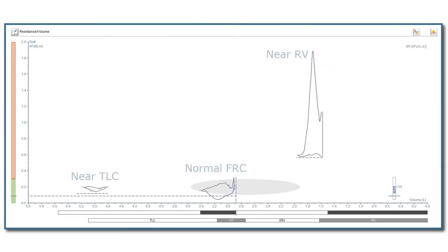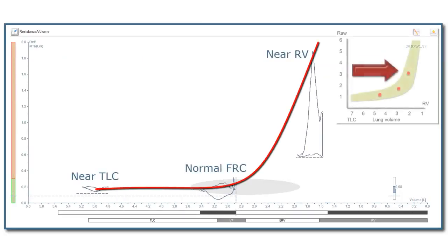When we compare the resistance-volume loops of the three different breathing levels, we can see that this has the same pattern as shown in this graph.